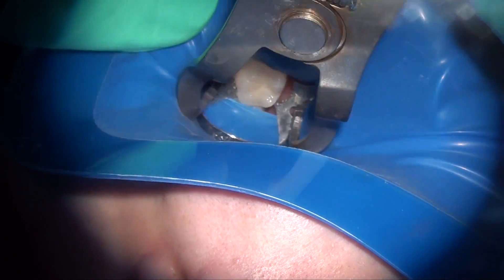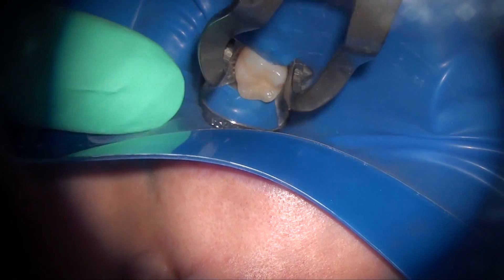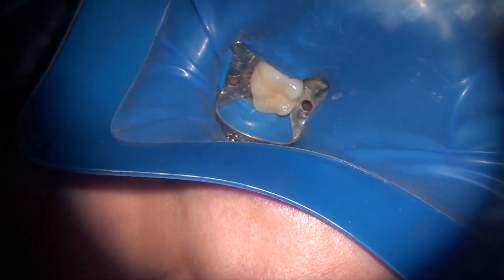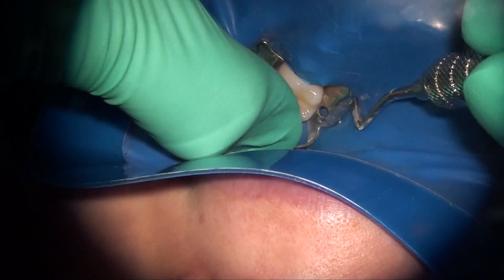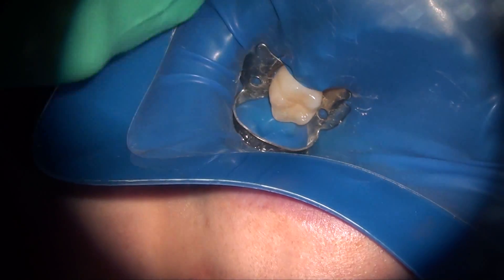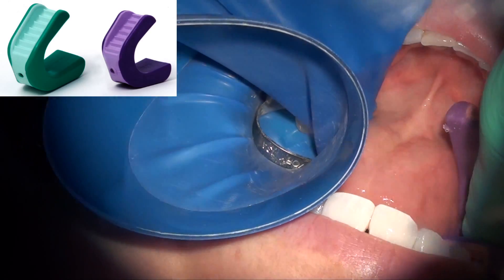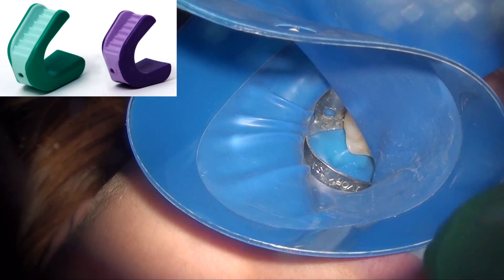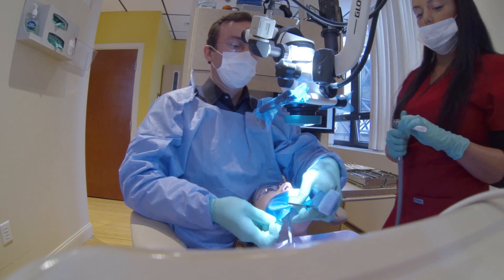I'm using a Handy Dam here to isolate the tooth using a 13A Hu-Friedy clamp, and then I'm inverting the rubber dam. You can see how quickly and easily you can isolate these individual teeth. I'm using these bite blocks by Common Sense Dental — the horseshoe shape allows you to get your fingers in there and work.